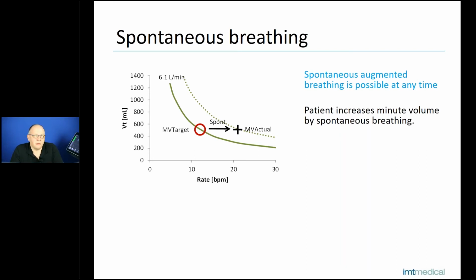So just keep the patient working when you want to wean the patient and when you have a goal to extubate the patient very soon. But always watch for signs of dyspnea. The patient shouldn't be exhausted on AVM. So this is the controlling job you have to do when working with AVM.